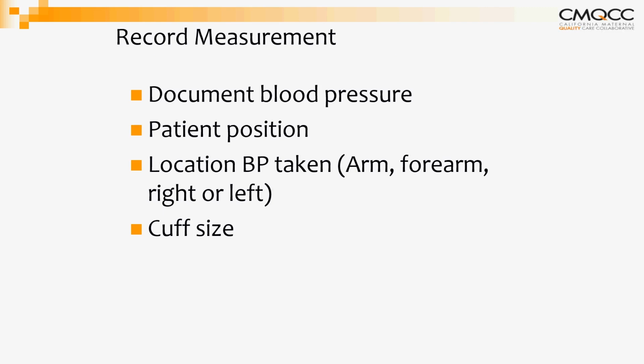Many of us work in facilities where we have electronic medical records where we can document the blood pressure. It's important to document the patient's position and the location where it was taken, whether it was right or left, and the cuff size if there's a means for that. If there's not a means for that, it's important that that cuff is placed in the same place so that it can be used for the same patient consistently. The important thing is really to get consistency.